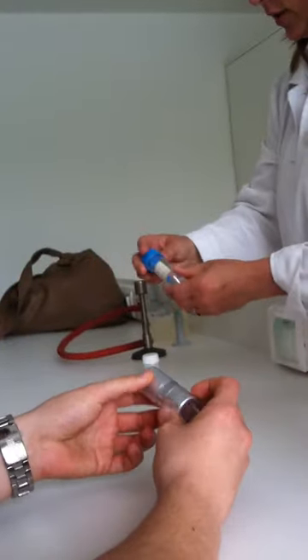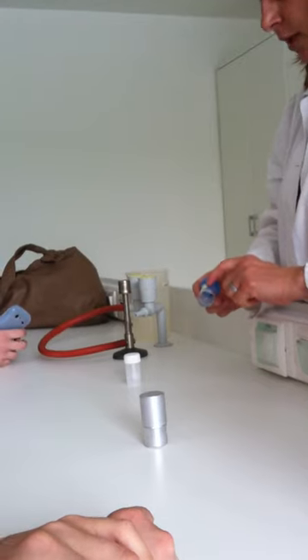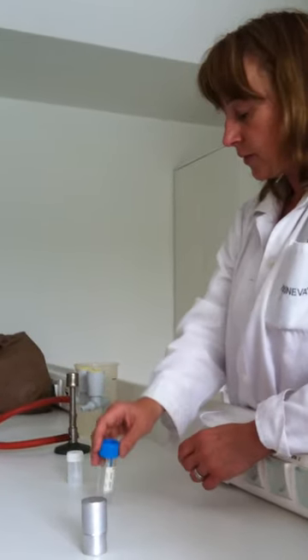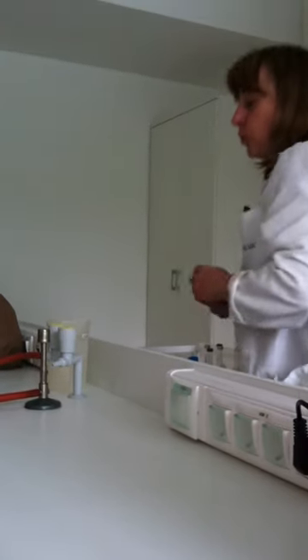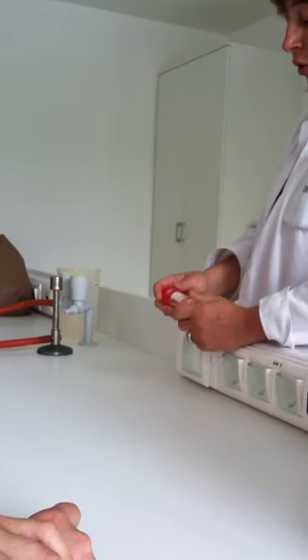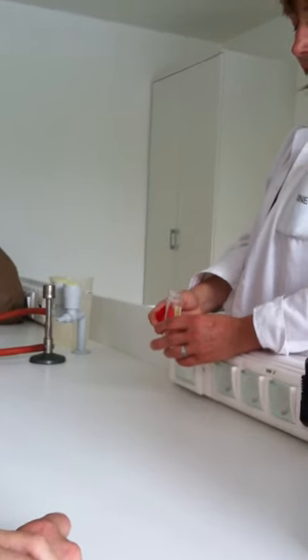And there is another one for stool, a little bit larger. It is always important to mention very carefully the name of the patient and, here in Hungary, the TAJ number, the TAJ code, and others, because we should recognize that this sample belongs to this patient, so it's a very important part. For sputum production, the sputum is also collected early morning, I mean the patient should collect it, of course, and before collection there is a washing of the oral cavity with water.